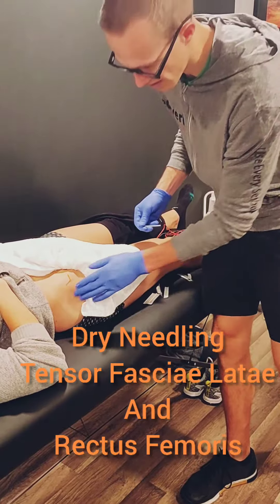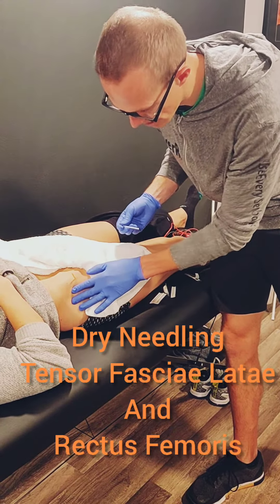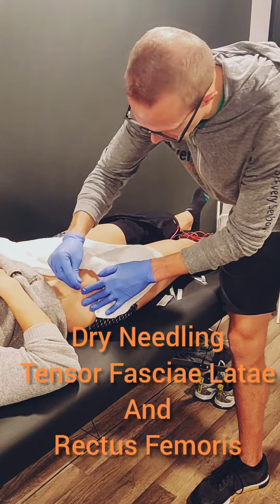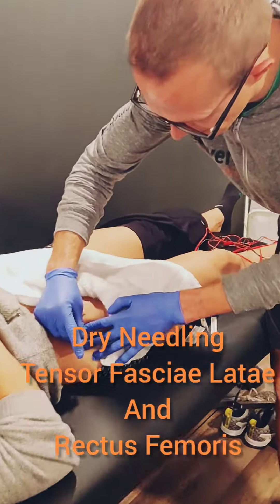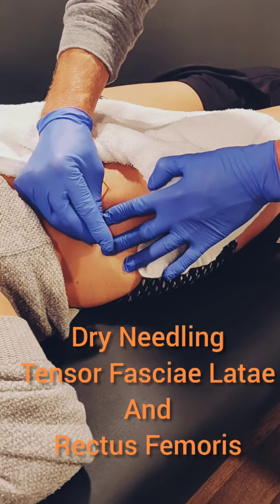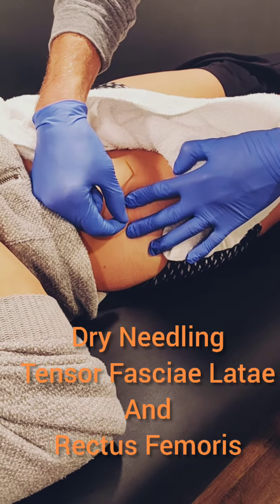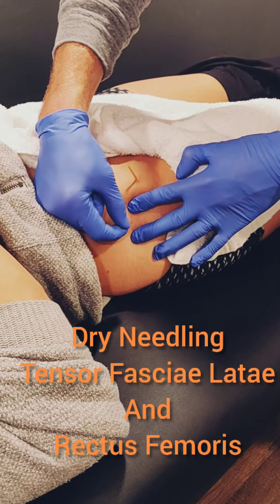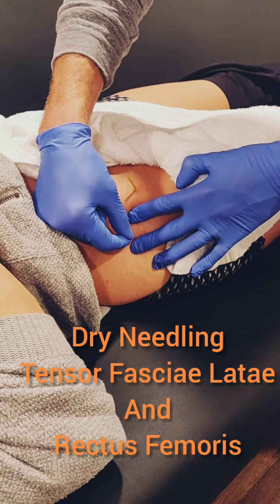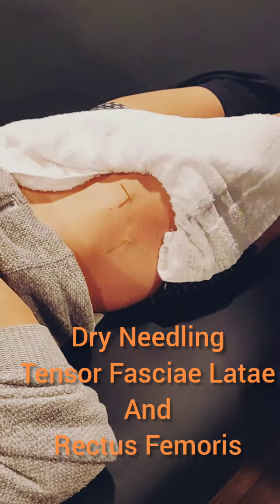Now I'm going to move over to her other muscle in the hip — the tensor fasciae latae, which has an attachment on the iliotibial band, which we all know can be somewhat problematic. Going to get in there. Another nice twitch response, getting a couple more. She had a good reaction, so that's good.